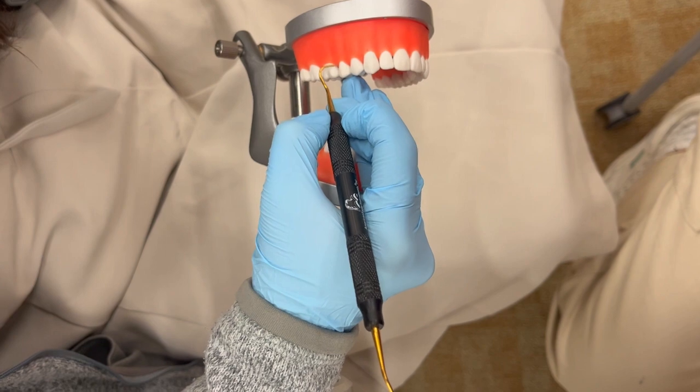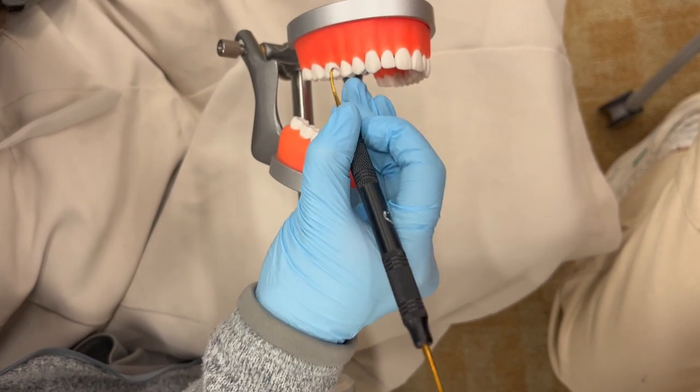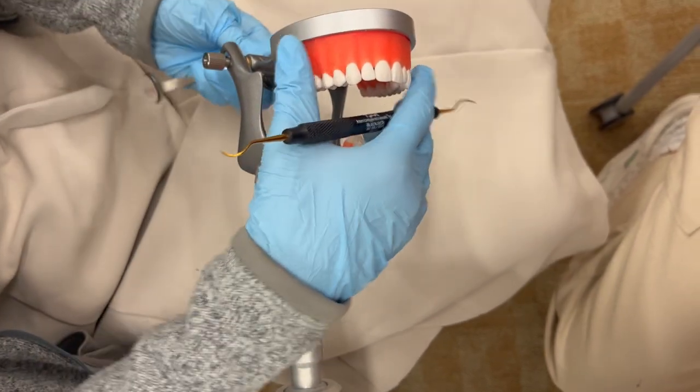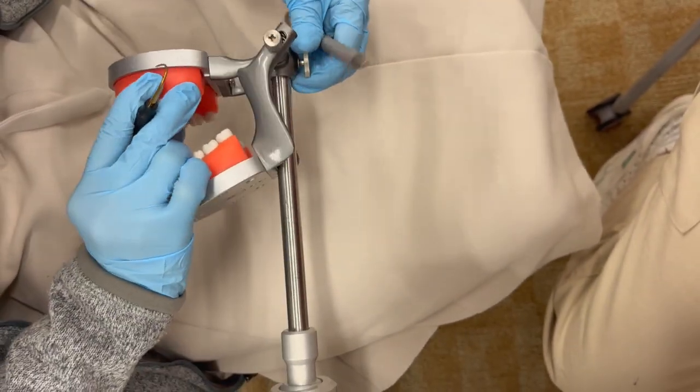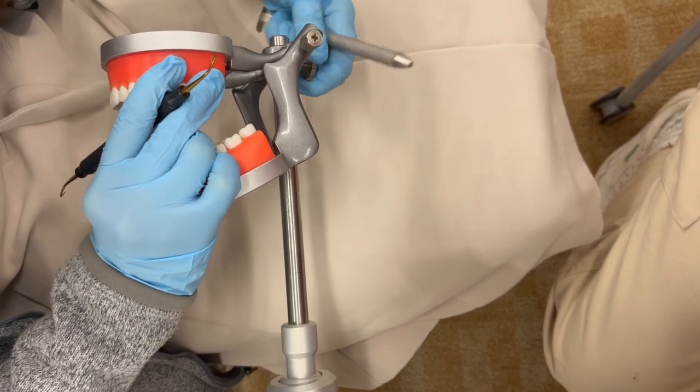So to define the cutting edges, you want to think inner means closer to the handle, outer means further from the handle. So the inner cutting edge is used for the distal surfaces, and the outer cutting edge is used for the facial, lingual, and mesial surfaces. So think I will start on the distal surface, then move out to the facial and mesial.